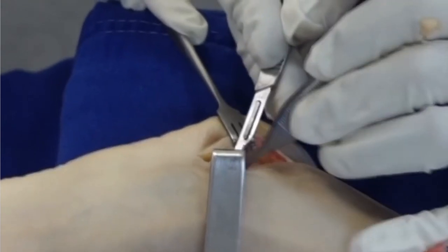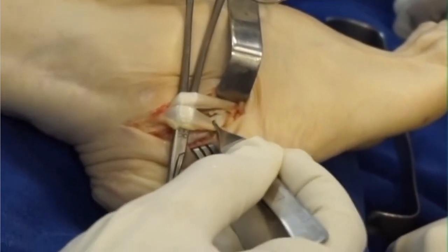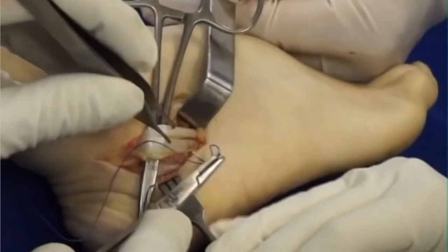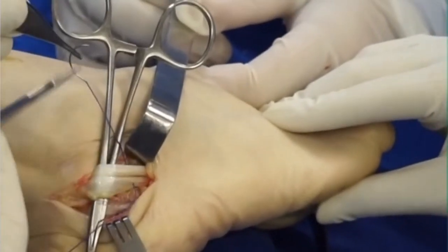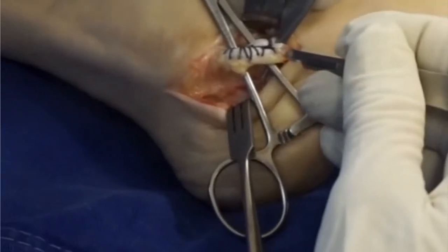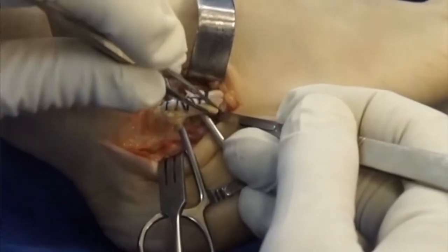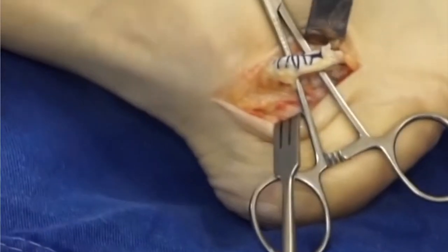The osteotomy is going to be not only a wedge but also a translation. Here you see the peroneal tendons where I'm going to suture the longus to the brevis. Note how hypertrophied the longus tendon is compared with the brevis, which is not being used and whose muscle is atrophied. I will suture the two together, and once you've sutured it completely, you can cut the longus. Don't cut the long tendon before you've got your sutures in, otherwise you will have incorrect tension on the peroneus longus. It's much easier to do your tenodesis or transfer once you've actually put your sutures in. Now you can see the longus has been cut and separated away from the brevis — that completes the tendon transfer.